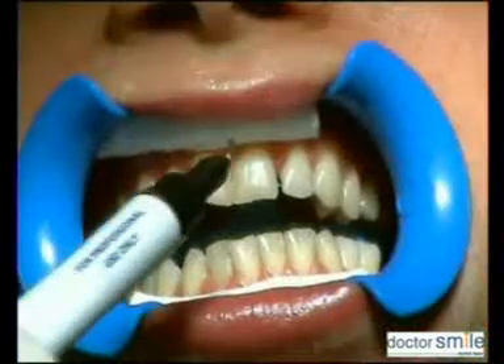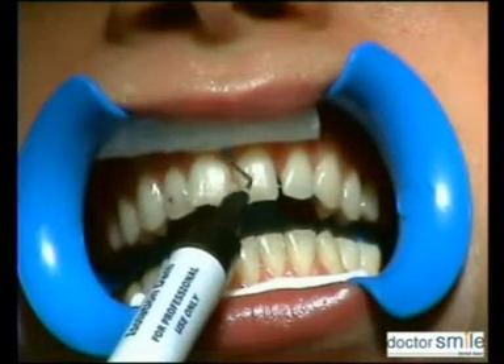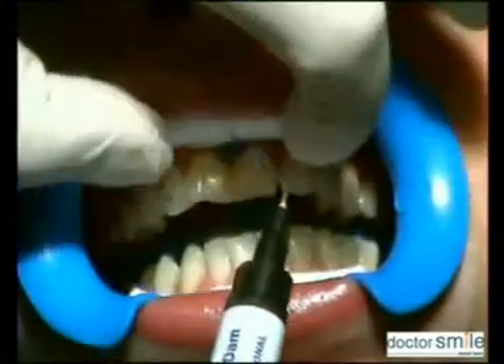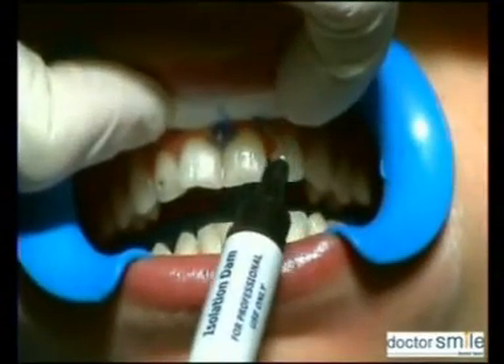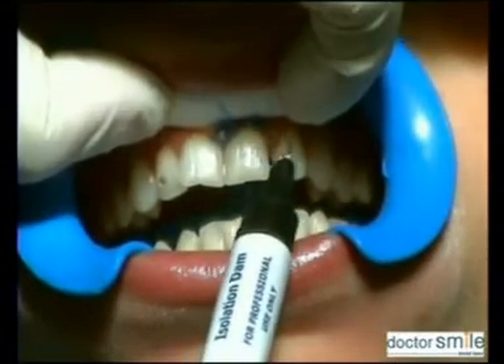First, clean the teeth with scaling and flour pumice. Place cheek retractors, then measure and determine the actual color grading of the patient. Dry the operative zone and apply the isolation dam into the gingival with isolate dam.